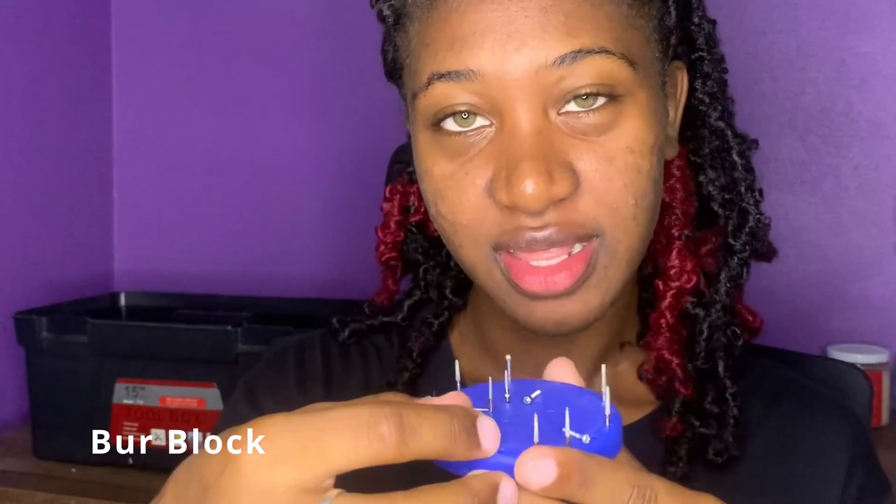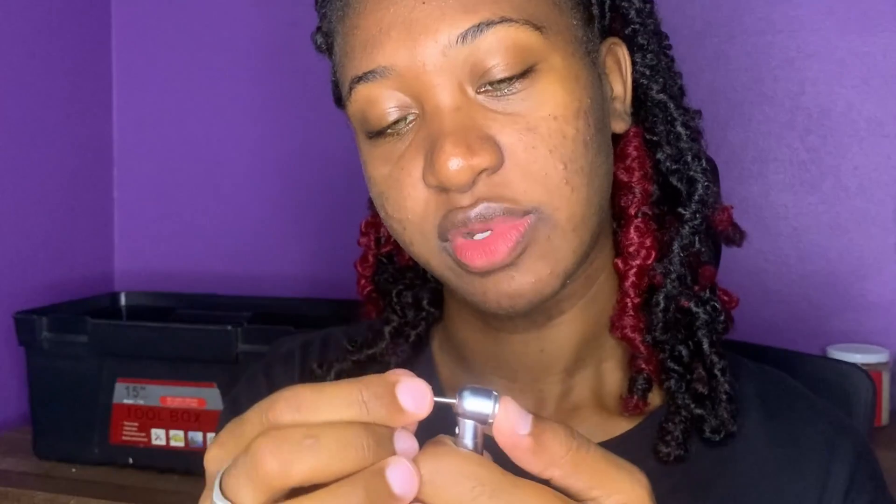Then I have my burr block. These small things that you see on it are burrs, and I would put these burrs into my high-speed handpiece like this. You put it in, press down on the back, and then it goes in.